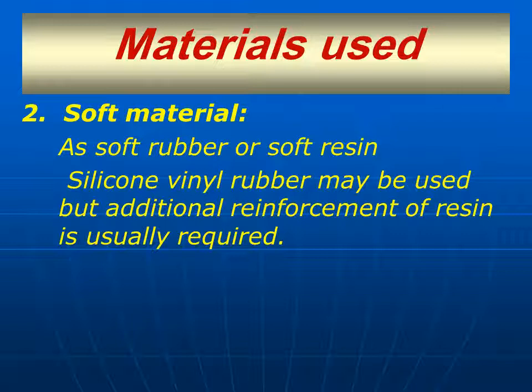However, additional reinforcement of resin is usually required. That's to say, it cannot support itself because it is very soft. It needs some support from the hard resin.